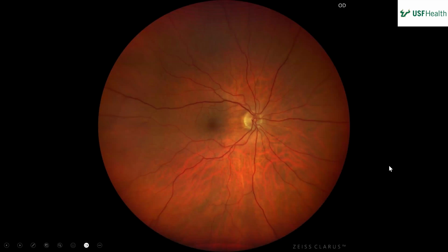So this is a color fundus photo of the right eye. The vitreous, the media looks pretty clear to me. The nerve looks sharp, pink, looks distinct, normal cup to disc, probably like a 0.2. You have a little bit of a temporal PPA or a little crescent. And then vessels look normal caliber, not too tortuous.